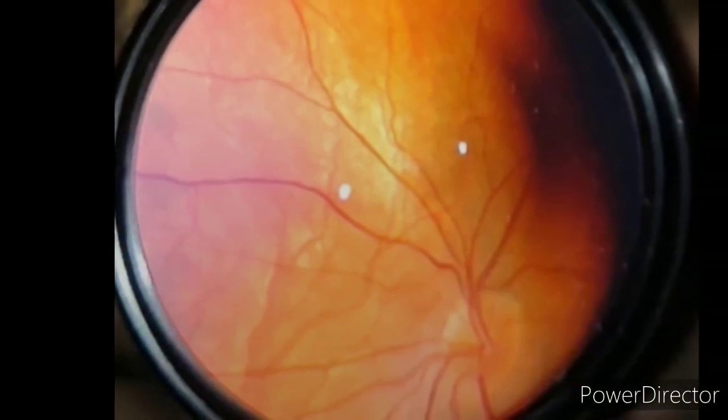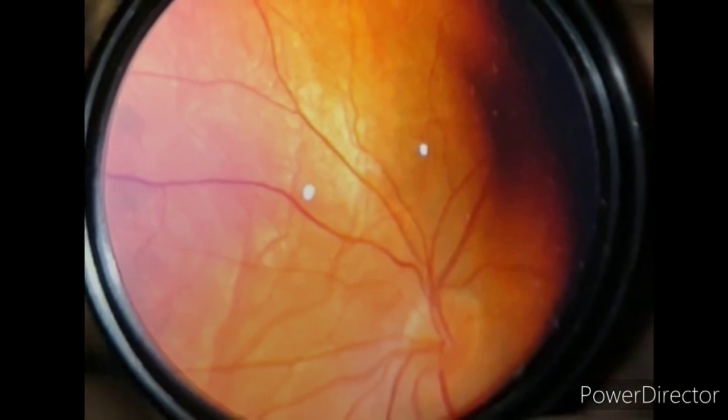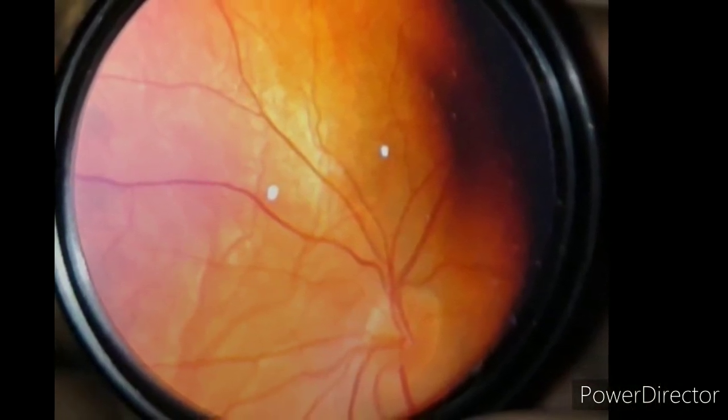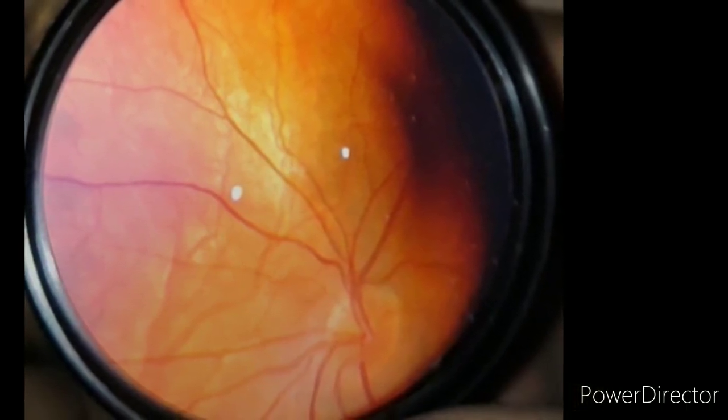I am Dr. Sharjeel and today I would like to tell you how to determine cup-disc ratio because a lot of students find it confusing. In the first picture there is absent cup. You can see all the healthy neuroretinal rim covering the disc area, so that's absent cup.